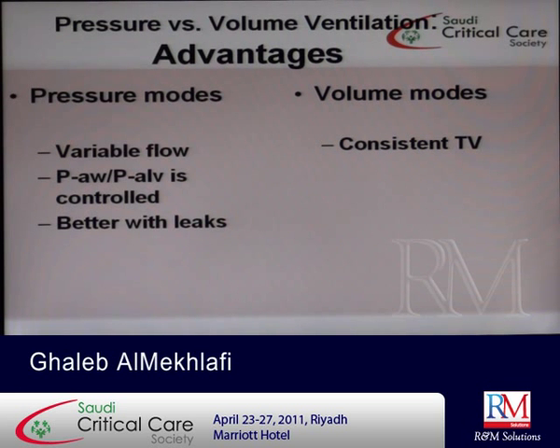But in pressure, of course, I cannot make sure about that because it's the pressure which drives the flow. Okay, and if there is any change in the patient's lung mechanics, and the pressure in the airways is higher, once that pressure is reached, the flow will be stopped. So the patient will get low tidal volume. So this is the advantage in volume modes: I'm sure that the patient will take that volume, and I'm happy with that.